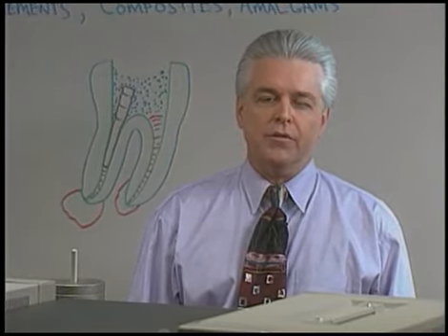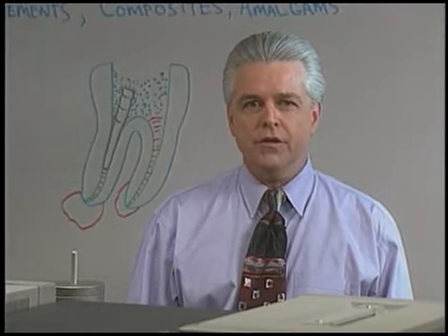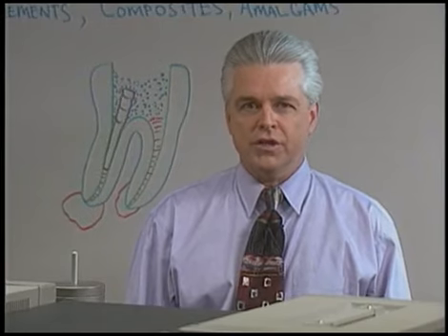Historically, when a clinician saw a post in a retreatment situation, concerns arose that its removal could weaken, break, or perforate the root, or set the tooth up for a fracture. In this tape, we're going to show you how to carefully remove post with a little technique and today's technology.